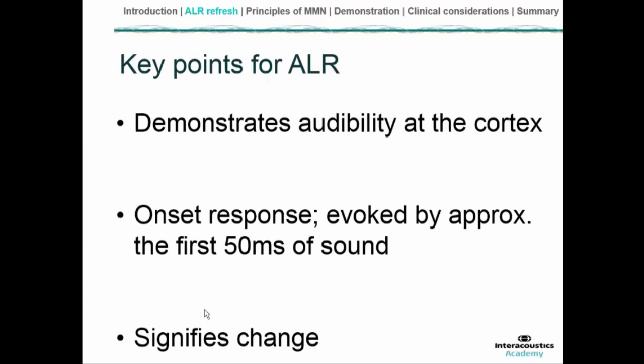So that's a brief overview, just to reiterate the key points: with the presence of this ALR, we've demonstrated objectively that the sound is audible at the level of the auditory cortex. I mentioned that it's an onset response. It's evoked by approximately the first 50 or so milliseconds of a sound, and importantly, as I mentioned earlier, it signifies change. The detection of that change is signified by the presence of the ALR.